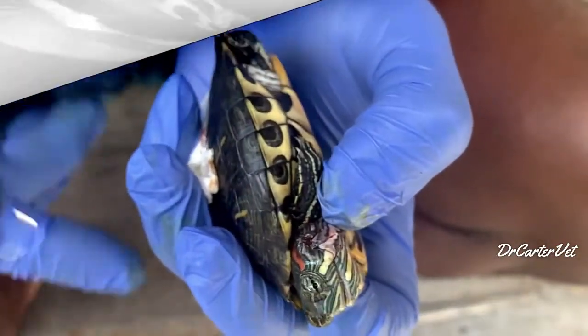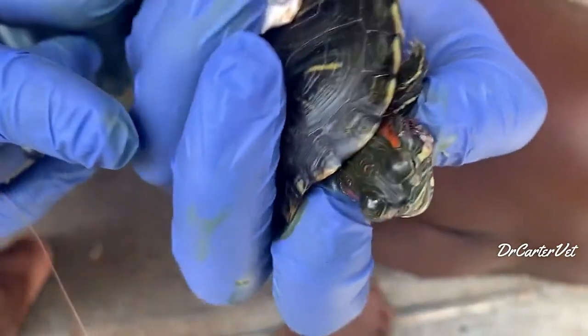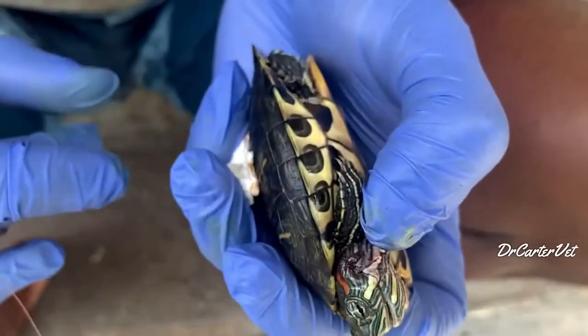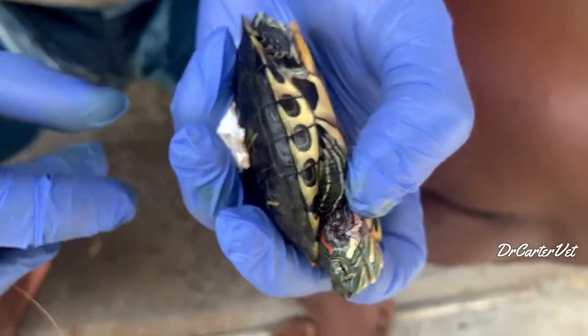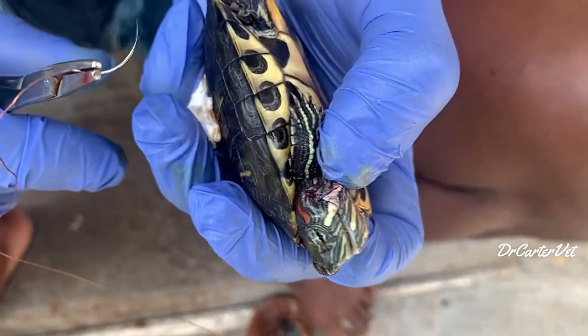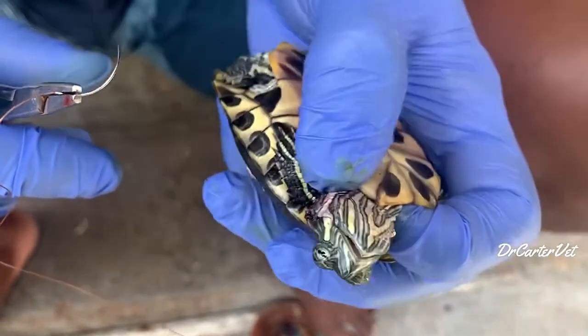I did give him some antibiotic therapy. It's a really small animal, so be careful what antibiotic you use. Make sure the tolerance level is good — use an antibiotic that's recommended for reptiles and small animal therapies.